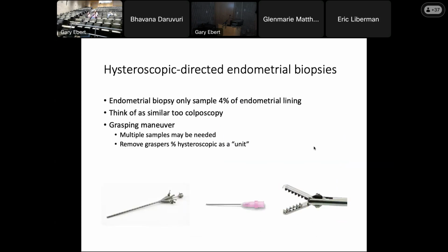However, the talk of this lecture is that hysteroscopy is basically the stethoscope for the gynecologist, and it's the gold standard. By looking inside, you can see lesions that you may otherwise miss, and I've had that several times. Endometrial biopsy in the office was atrophic endometrium, do a hysteroscopy, and it comes back that there's cancer or complex hyperplasia with atypia.